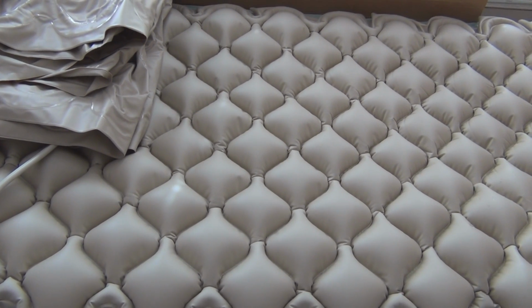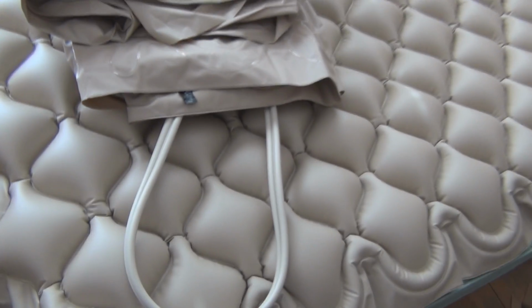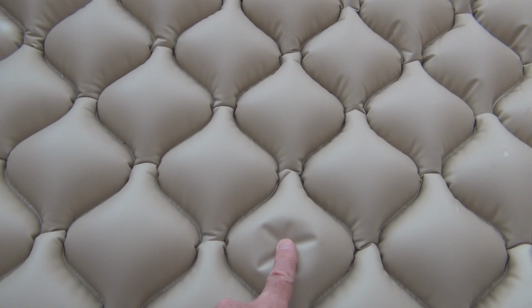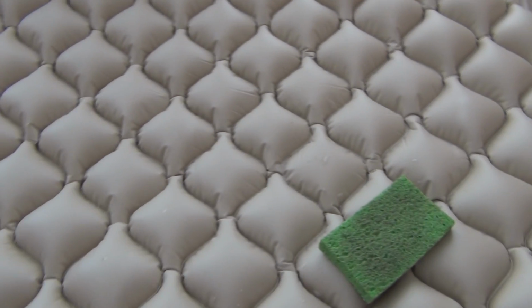And yesterday the medical supply company came over, because the first time I called when the first mattress went, they immediately delivered one, and it's really self-explanatory how to take it and hook it up to the pump. You just have to disconnect the tube, these two tubes here. And how this works is it has all these individual chambers, and every other one here, they'll all get inflated and deflated at the same time, and vice versa for the other two. So these chambers alternate in inflating and deflating, and it relieves the pressure, so there's not a constant pressure that you would get with someone just laying down on a regular mattress. It alternates, thus they call it an alternating pressure mattress.